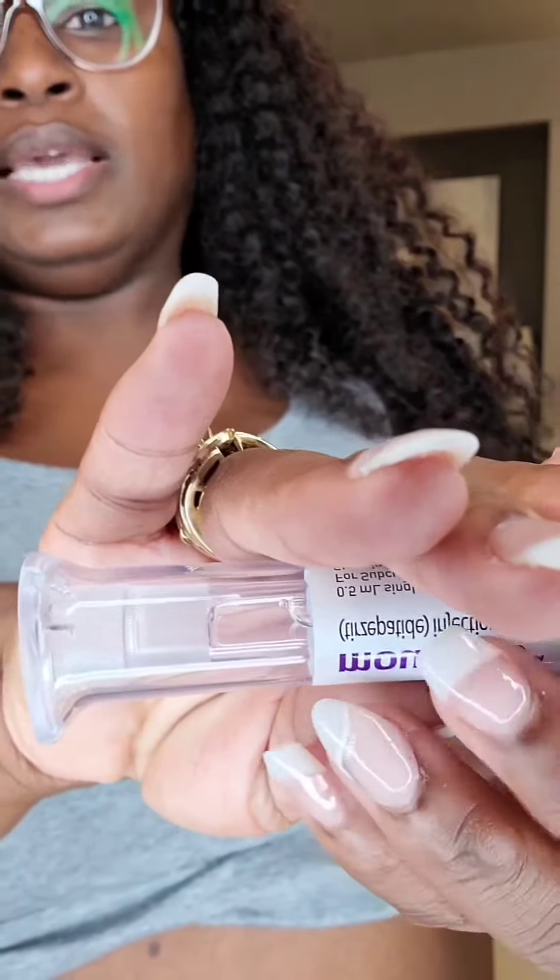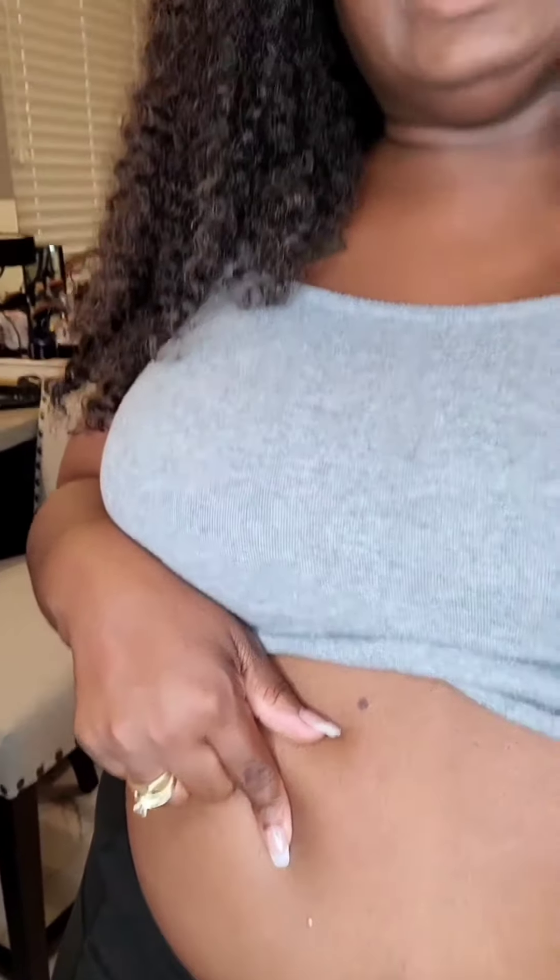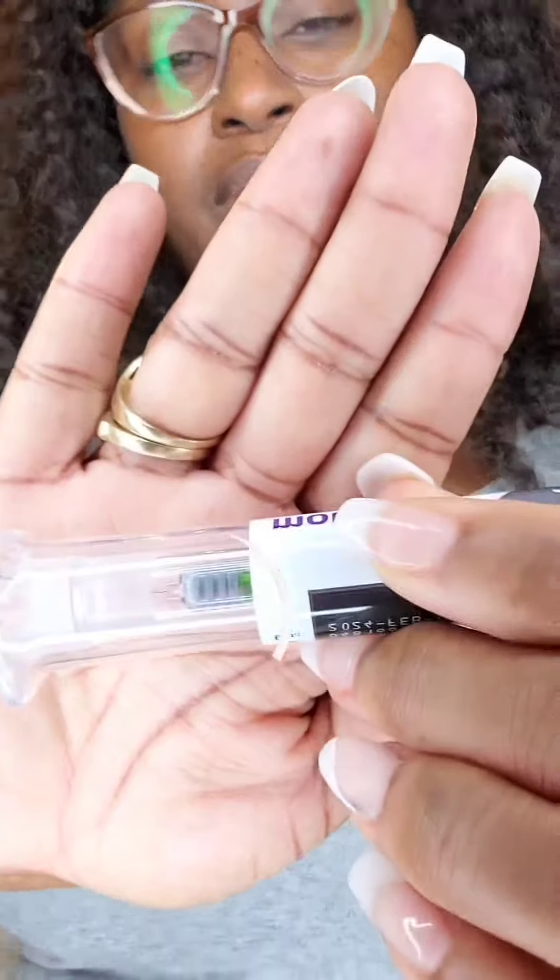Here we go — I pinch, because you can't really feel it if you pinch. You can see I have like a little dot there; that was my injection site. And then you'll see the gray plunger, which has identified that the injection has been given.